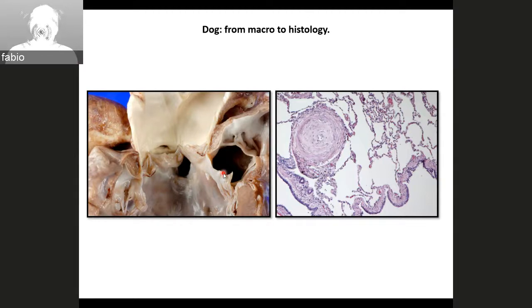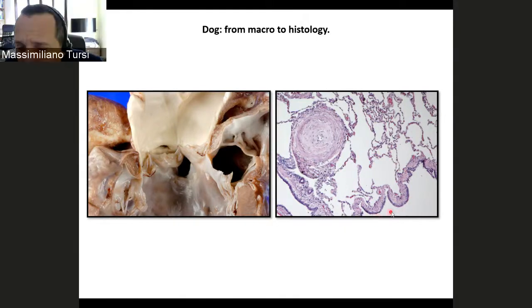Okay. From the histopathology, I think it is a lung. I agree with you. Good. Why is it lung? Well, I can see the alveolar and the epithelial of the alveolar surrounding it. Not endothelial, epithelial. Sorry, the epithelial. Yeah. And that's the alveolar. That's a part of a bronchus here.